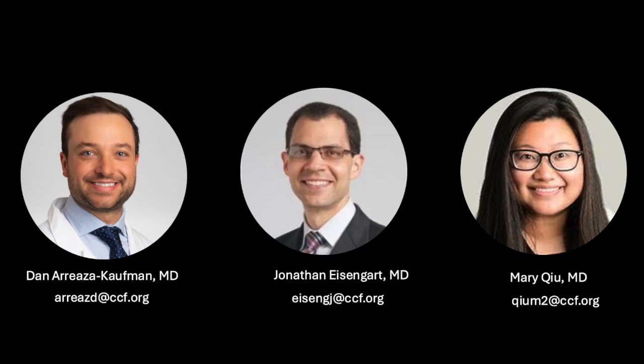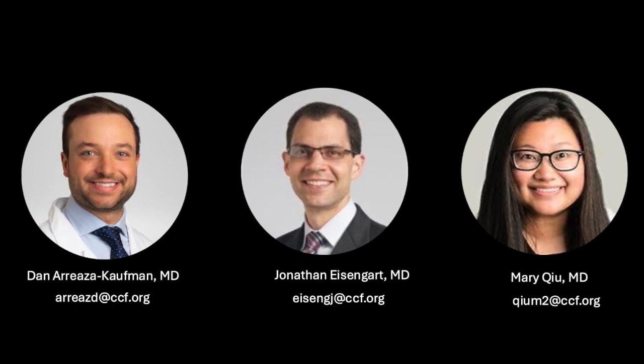Thank you so much for watching our video. We hope you will consider trying the iTrack Advance to perform 360-degree pressurized canaloplasty in patients with open-angle glaucoma. Please email us if you have any questions.